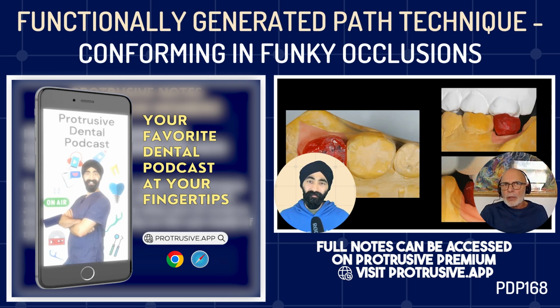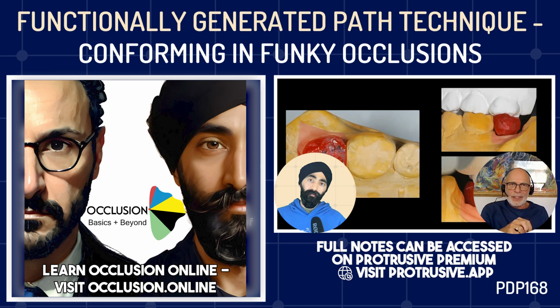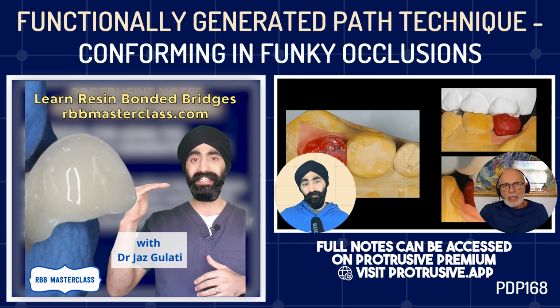The only comment I would make about using composite is, particularly if you're working in analog, what you have to be really sure is that what you've cured in the mouth fits correctly on the cast model of the tooth, because that's sometimes not the case. And then when your restoration comes back, it's not 100%. So that's why, in terms of working with a patient digitally, that's less of an issue to bring them back. But sometimes, my way, you have to bring the patient back once additionally.